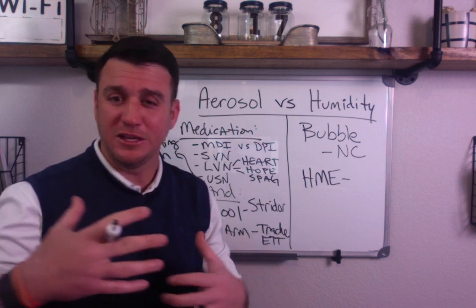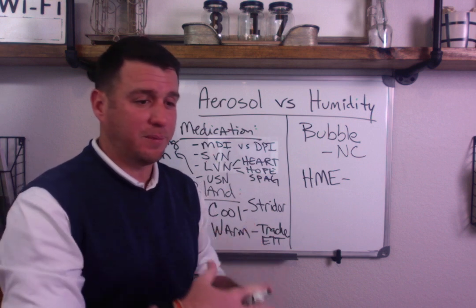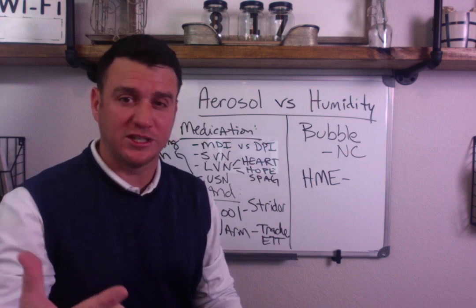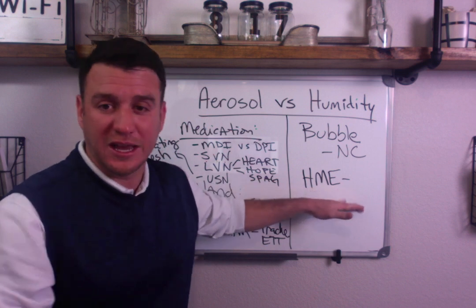But the key is that anytime you're using an HME, it should typically be used for short-term mechanical ventilation. If your patient has an extended time on a mechanical ventilator or has very, very thick secretions, then an HME is not going to be the best mode of humidification for that patient.